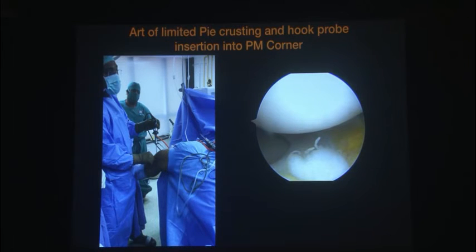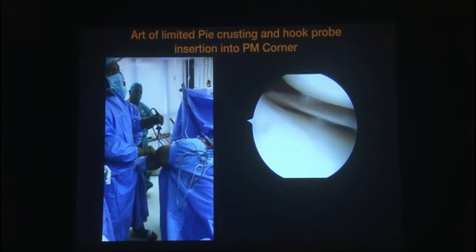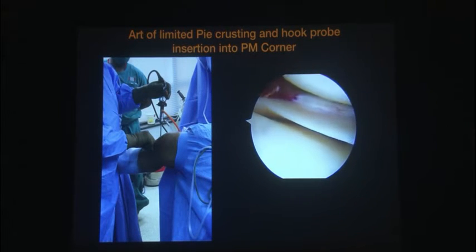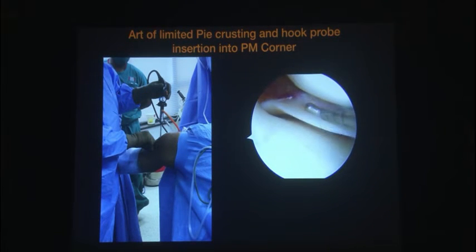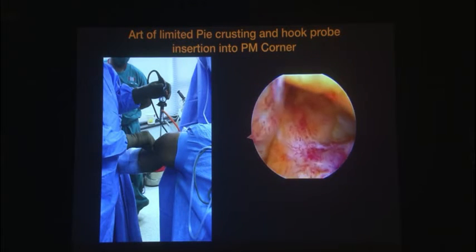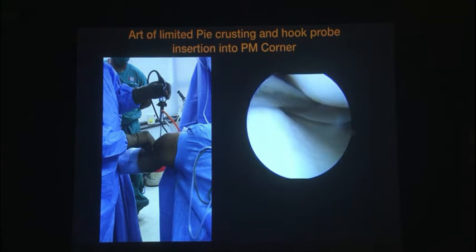The first thing you need to understand on the medial side especially is how to create a pie crusting. I feel for the joint line, go just distal to it, create micro fenestrations, and that opens up the joint well for you to visualize the zone of the tear. Make sure bulky instruments can come in without scuffing the cartilage. Plan the number of stitches you need. The ability to go to the back and visualize the red-red and red-white zones — all of these advantages come with pie crusting.